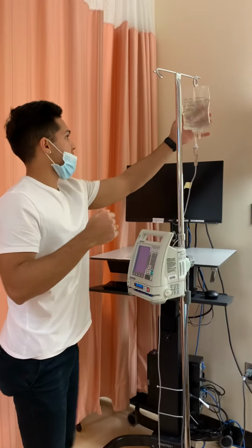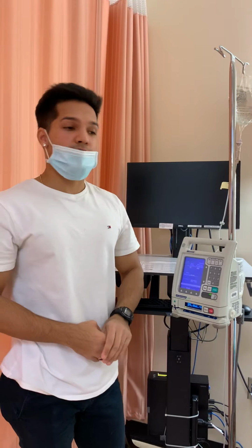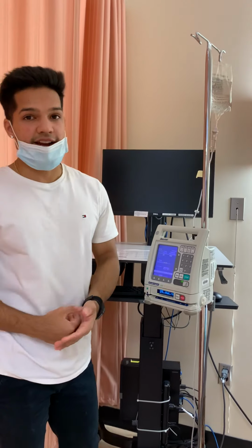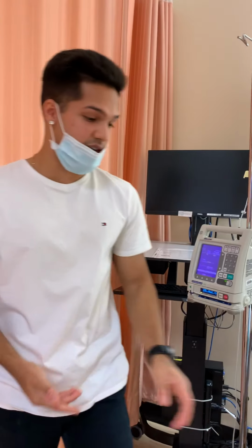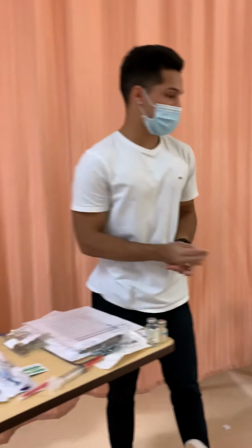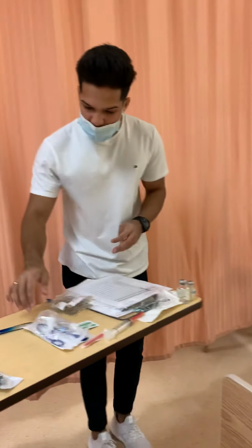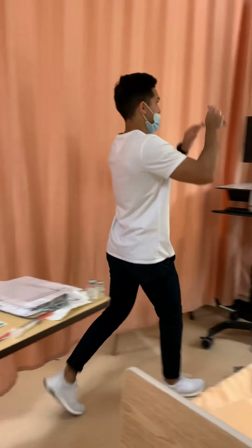And I'm going to be looking at my primary medication. It is normal saline, which I know is compatible with my secondary medication, and the primary tubing and the bag has already been labeled by the previous nurse, so I know it's not expired. It's good to use. Okay, so now I'll be doing hand hygiene, and now I'll just be hanging up my primary lower than the level of my secondary.